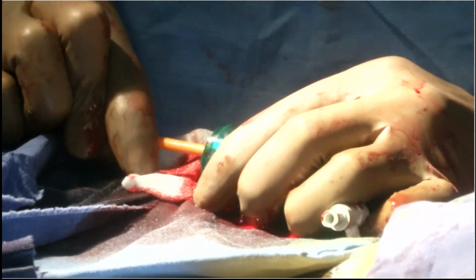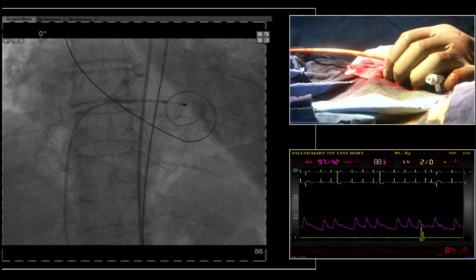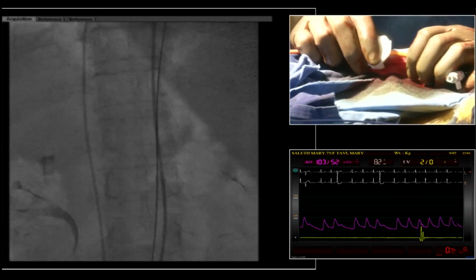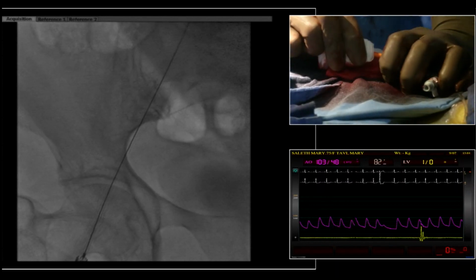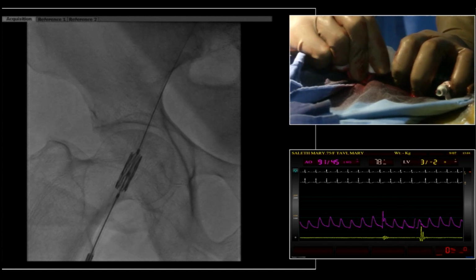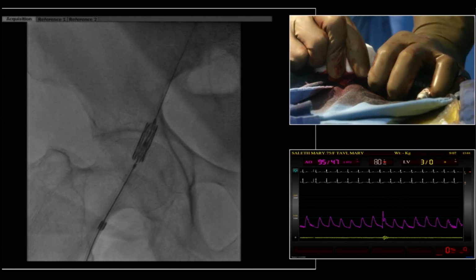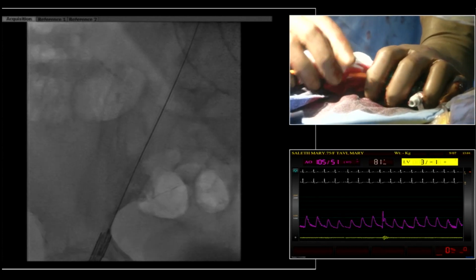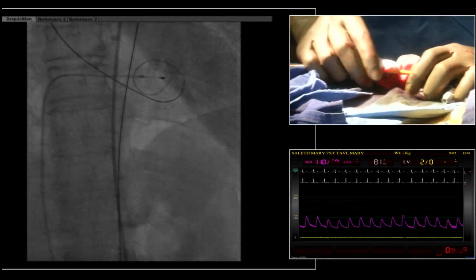And you also have a stopper, proximal and distal to the stent, which makes the stent not move when you are sometimes pushing it. With this Python sheath, there can be a little problem, because earlier we were using the 26 French sheath. Now this is the Python because it is an expandable sheath. Once you're pulling back, it can be a problem. Show the wire.